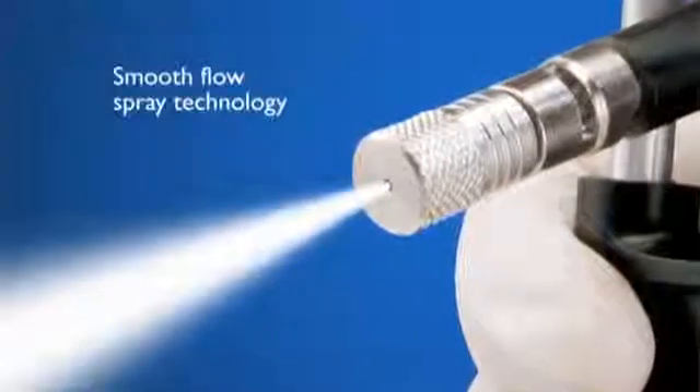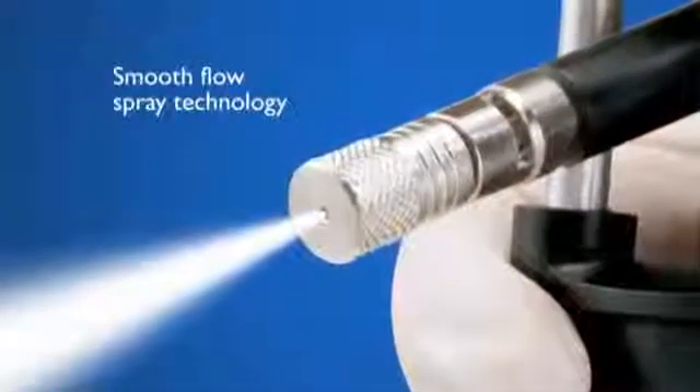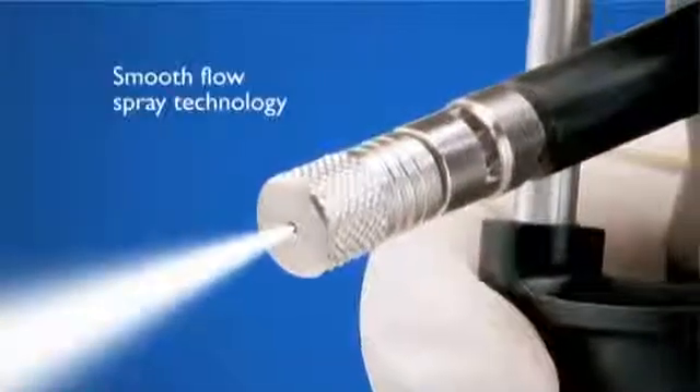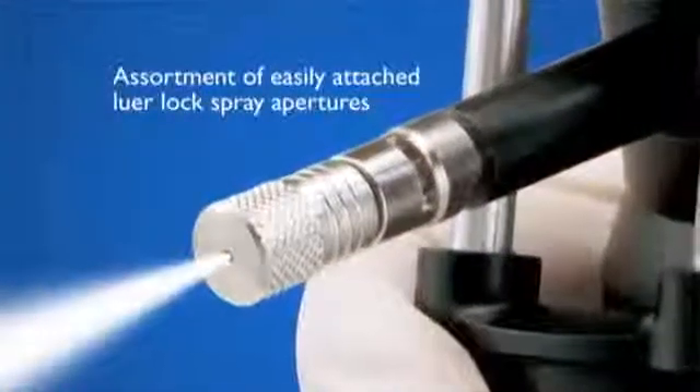UltraFreeze's Smooth Flow Spray technology ensures that a controlled spray of liquid nitrogen is delivered to the treatment site each and every time, through an assortment of easily attached luer lock spray apertures that come with the system.